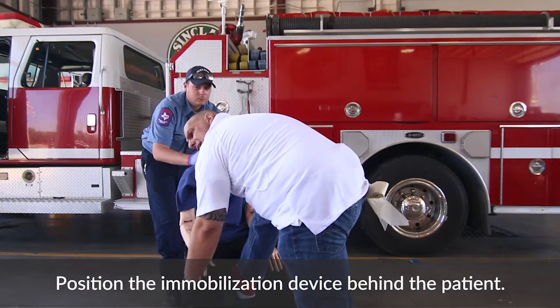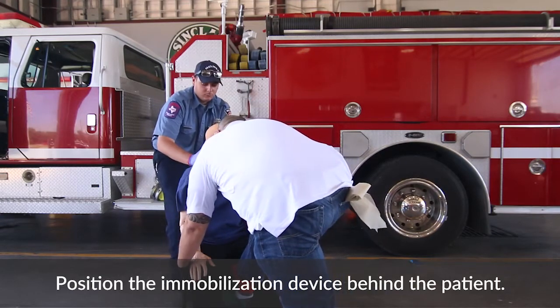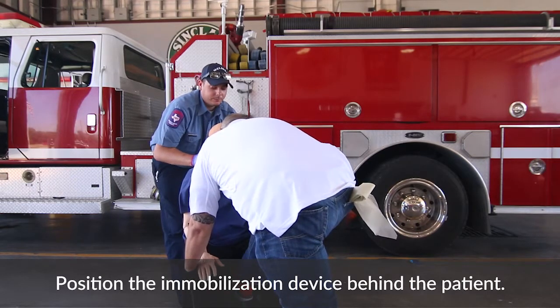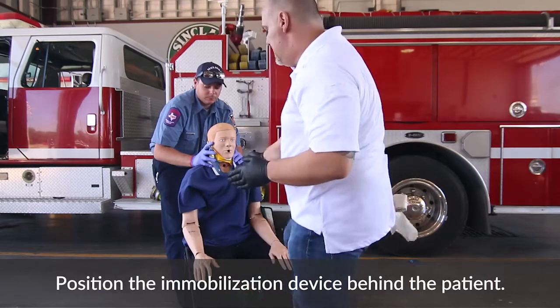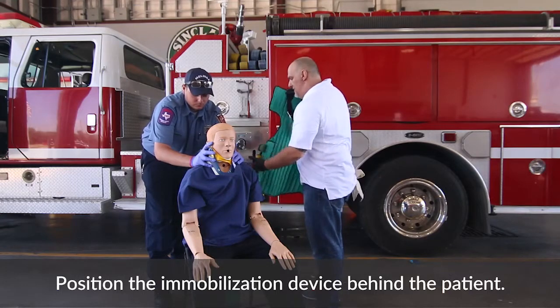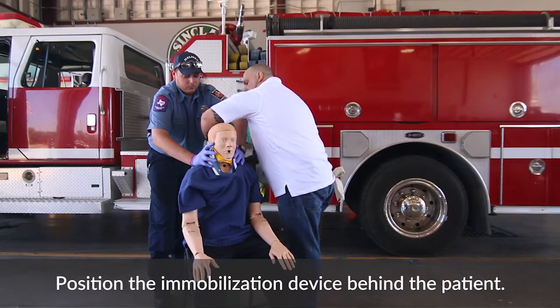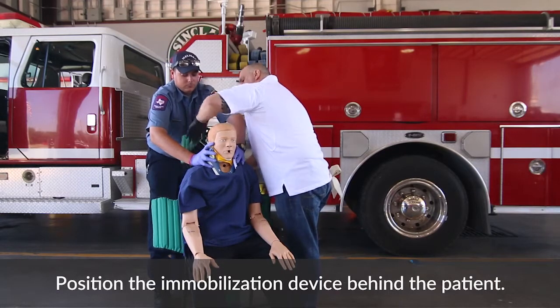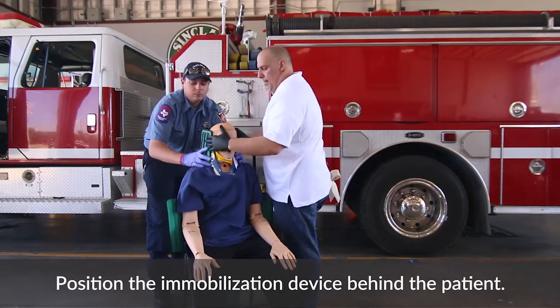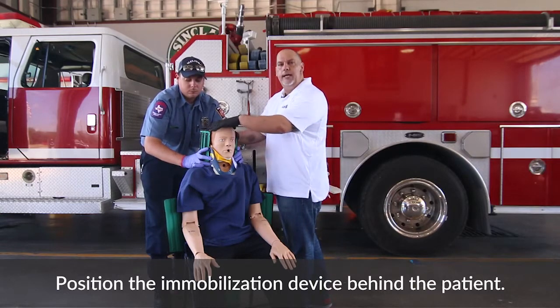I'm going to grab the patient behind the knees and ask my partner to count to three. As one unit, I just want to move the patient forward without really banging them. This is an easy way to make some space behind the patient to get the device in. Working with my partner, I'm going to slide it in, bring the head collar forward, and now my partner is going to hold the head collar of the KED.